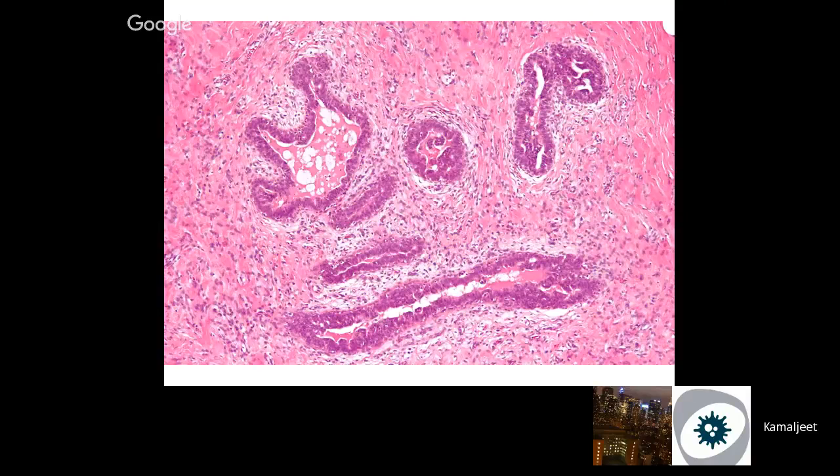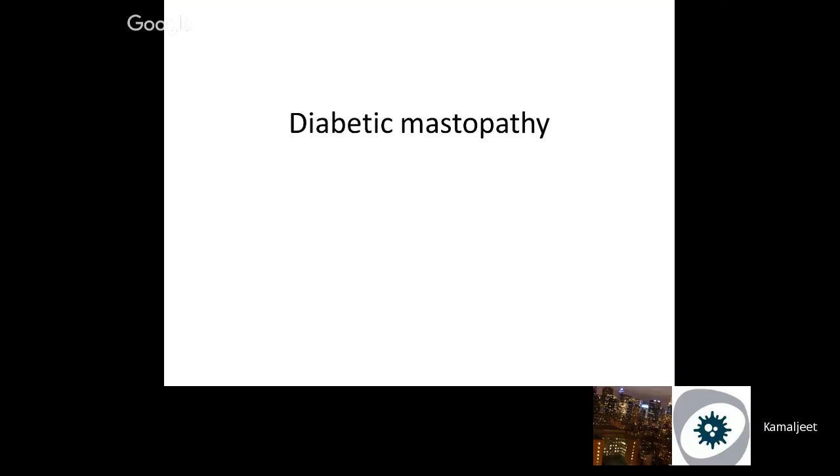More pictures where it gets a little florid. Atypia in gynecomastoid hyperplasia is very rare, and ADH is extremely rare. So if you're about to make the diagnosis in the board, just stop and think, could it be just florid gynecomastoid hyperplasia? Diabetic mastopathy. I didn't have a picture.